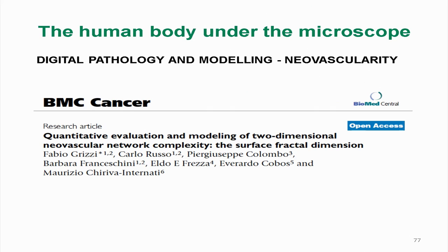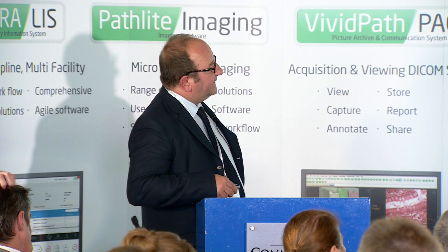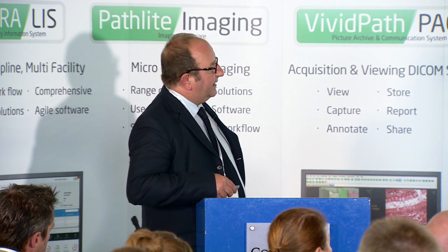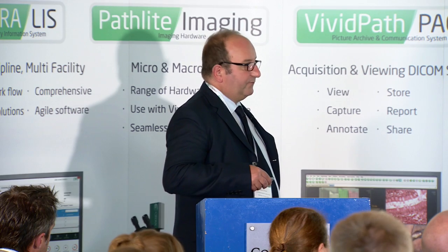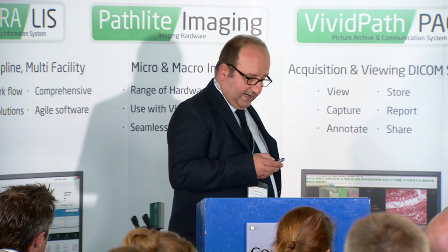This kind of approach led us to propose, for the first time, the quantitative evaluation and modeling of 2-dimensional neovascular network complexity, introducing the fractal dimension. And we have another concept here: when I cut the histological section, I can find a different number of vessels. Actually, the number of vessels is a subjective measure made by the pathologist, the so-called microvessel density.